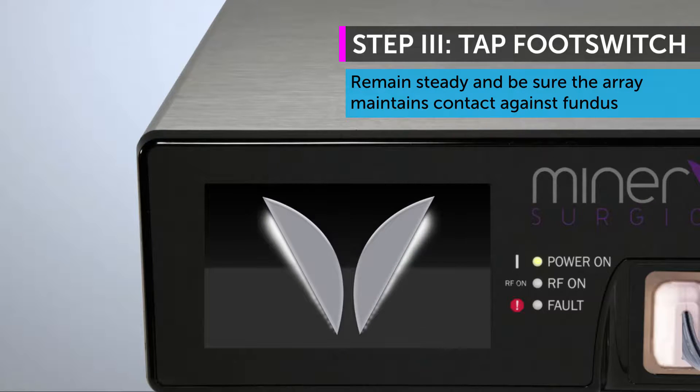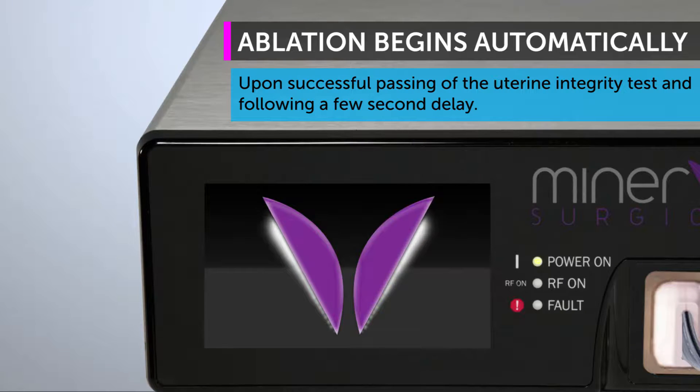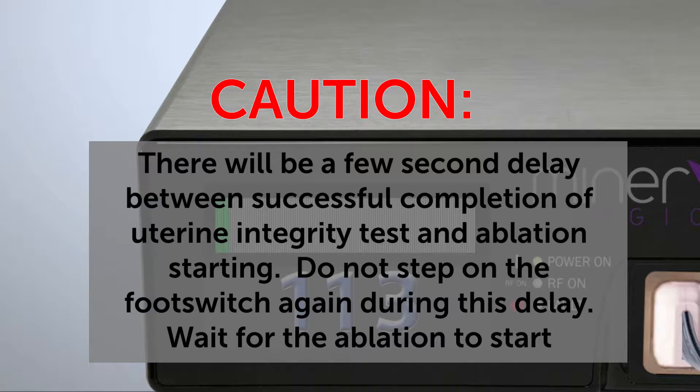Please remain steady during the uterine integrity test and maintain correct placement of the array against the fundus. Upon successful passing of the uterine integrity test, the ablation starts automatically. There will be a few seconds delay between successful completion of the uterine integrity test and the ablation starting. Do not step on the footswitch again during this delay — just wait until the ablation starts automatically.